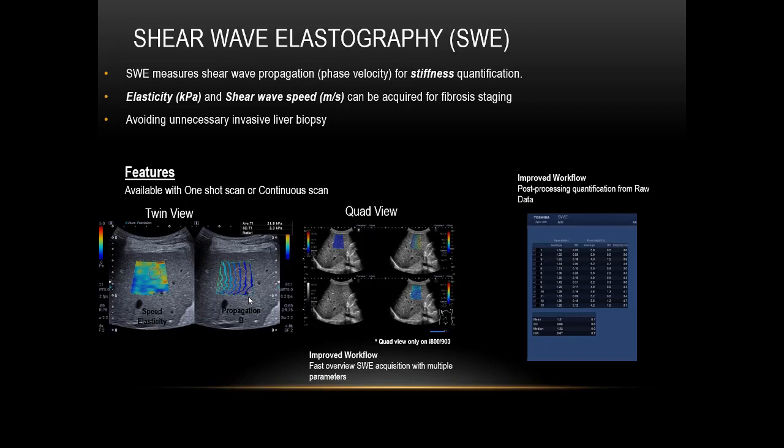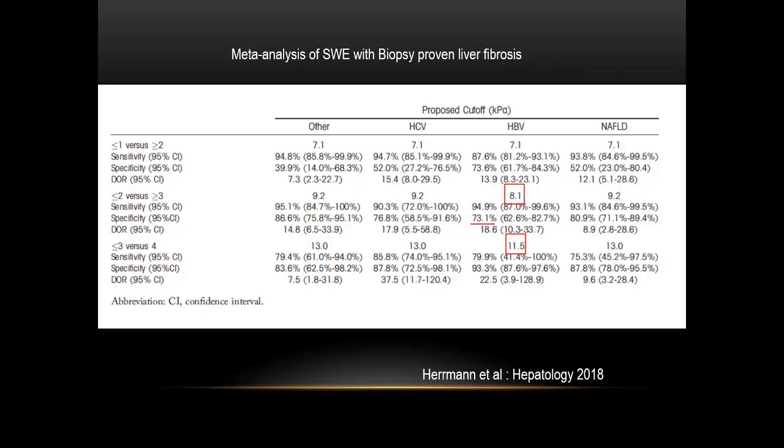Let's see, there's a motion artifact that can influence the area of the stiffness on the color elastography. Let's say this area maybe has less stiffness, and this area is high, right? But if we see the propagation map, we select the area where the lines are parallel together. That means it's constant. We prefer this area to measure. And then we measure and calculate the mean, median and IQR to report, as with FibroScan.